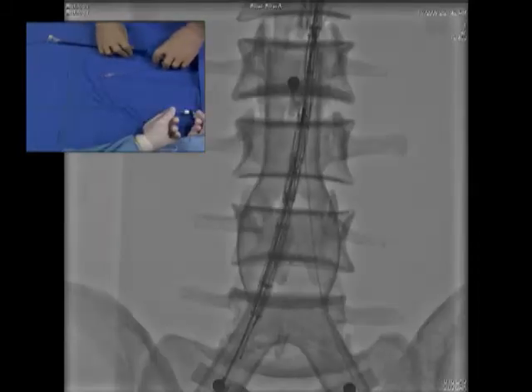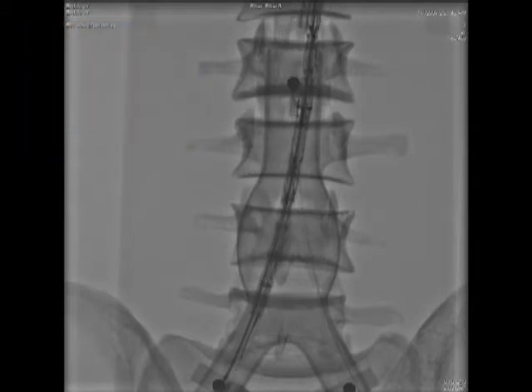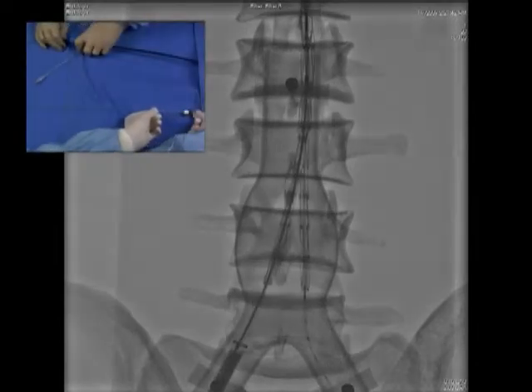Stabilize the inner core assembly and pull the retraction hub until the RO marker on the introducer sheath is about 1 centimeter below the aortic bifurcation. Ensure the contralateral limb is released from the introducer sheath and gently pull out the slack in the SurePass wire.